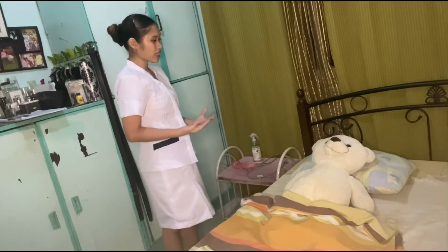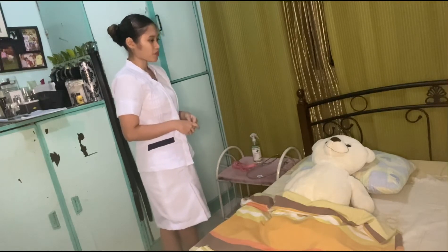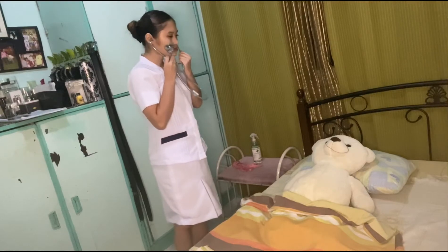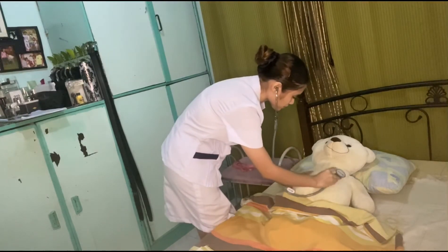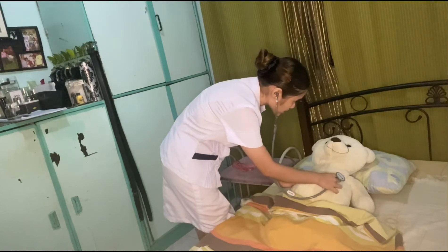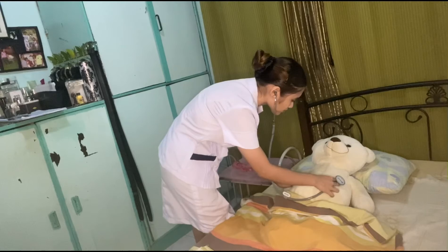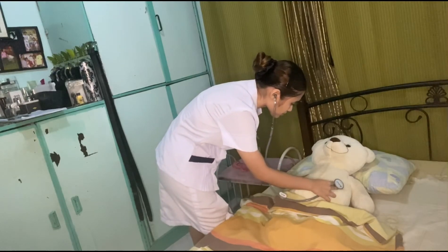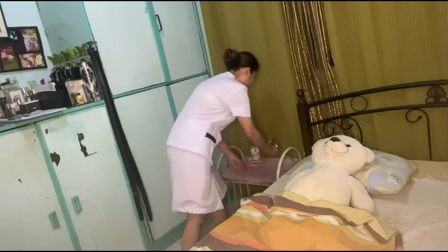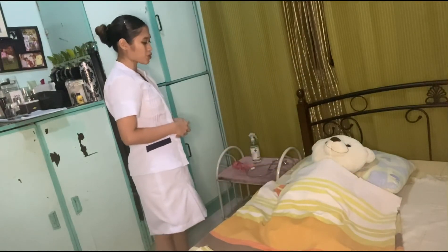Mrs. Cruz, for the next procedure — the fetal heart tone — I will place the bell side of the stethoscope chest piece on the fetus's convex portion closest to the anterior uterine wall. Listen by pressing firmly and very gently. Count a full minute holding the stethoscope chest piece while the other hand feels for the client's radial pulse. The baby's fetal heart tone is in normal range. Now I can put back your blanket so you can rest.